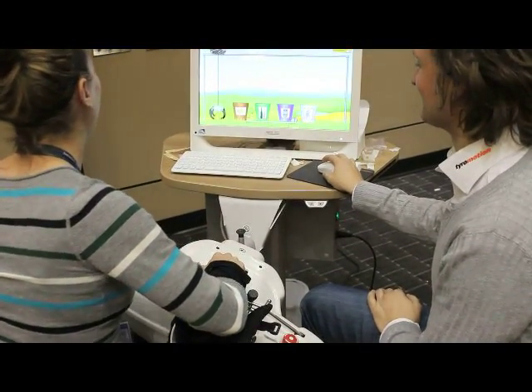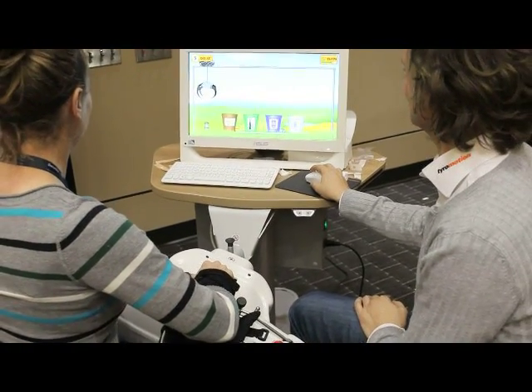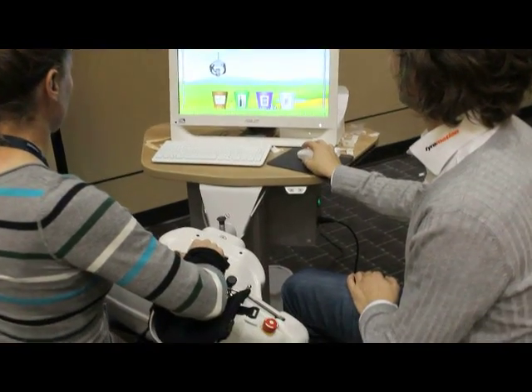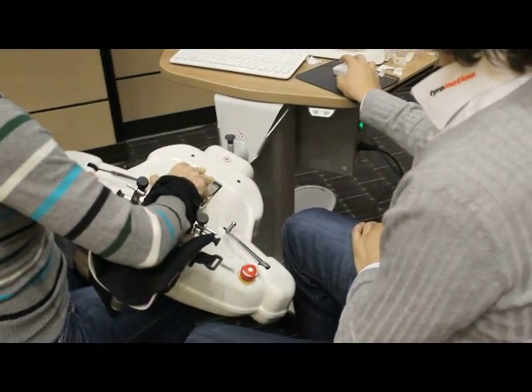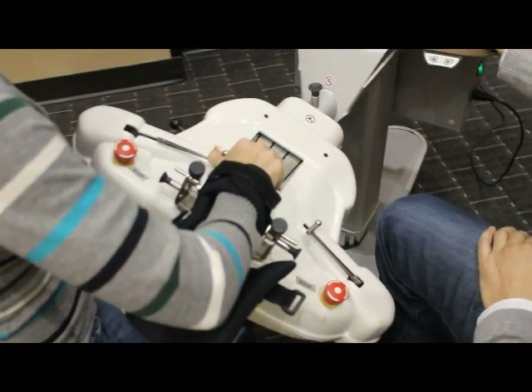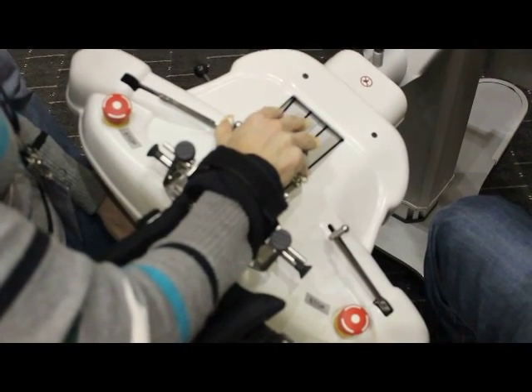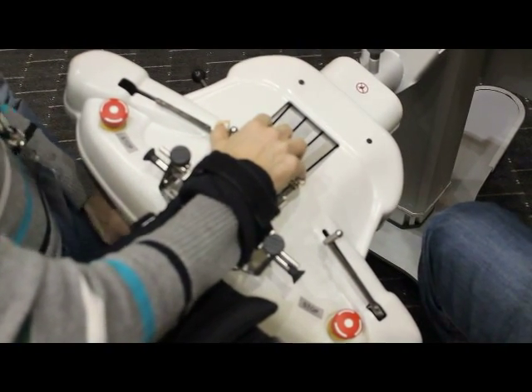You see how much the motivation comes — I'm like, yeah, come on! Look how good at recycling you are. My little competitiveness kicked in there. 13 out of 14 — nice!